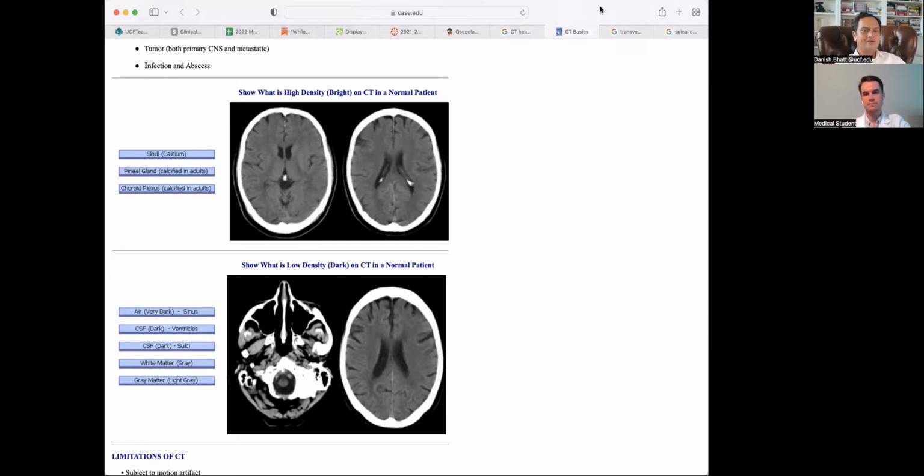And then you also have interactive windowing, where you can grab the screen and just change the windowing until you are able to see it, more or less grainy, as you want to see it. And all of that is artificial processing, by creating filters of this natural Hounsfield unit.